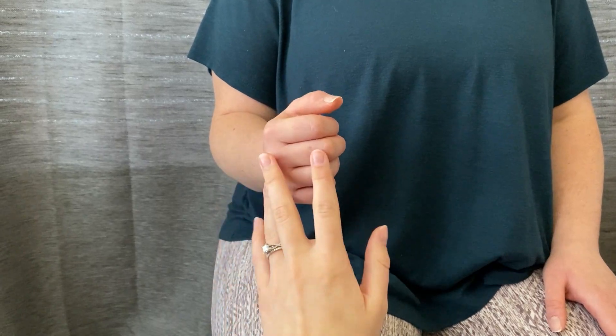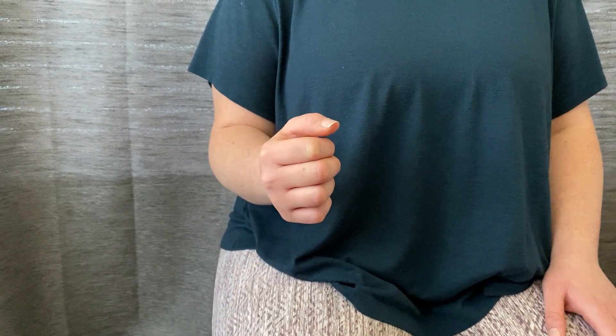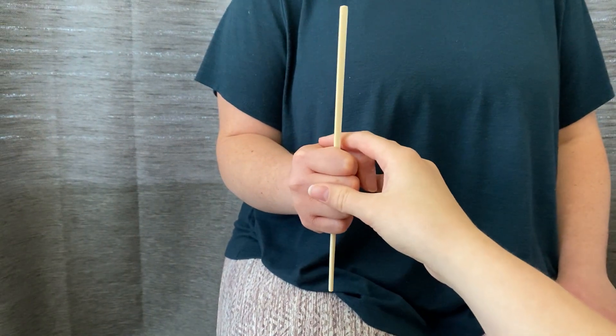Make sure you remove any jewelry, like rings, before you do the measurement. You're going to hand your patient a straight object. You can use a knitting needle or a paintbrush — this is a chopstick.